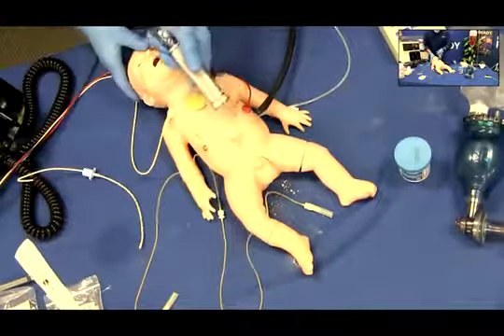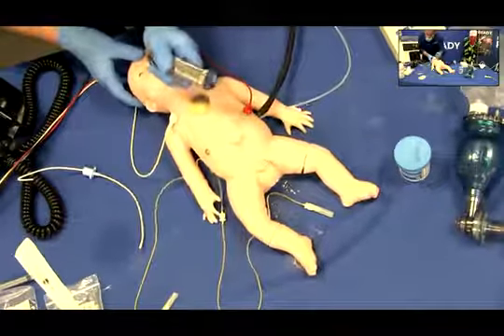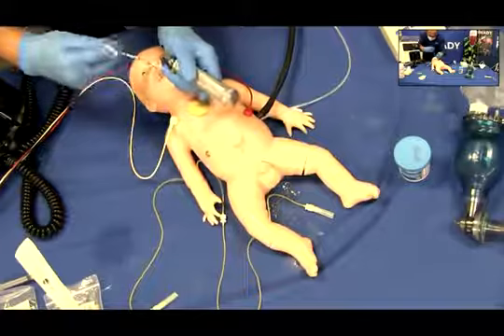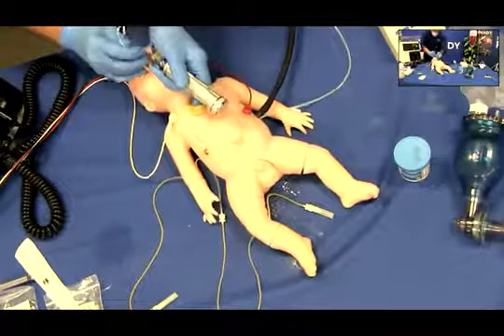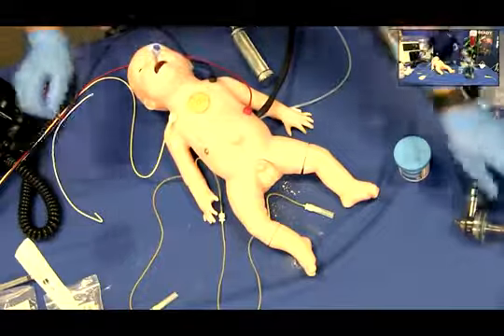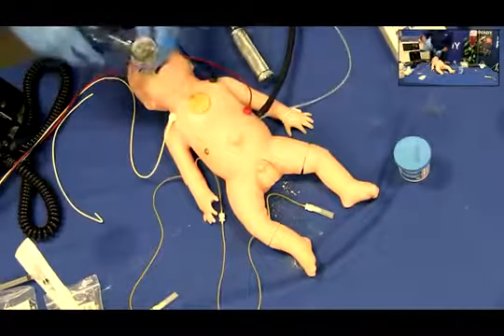Gently slide the blade into the mouth, depressing the tongue to view the airway. Insert the ET tube or laryngeal mask airway following general practice guidelines to place the tube. Then you will ventilate the infant airway simulator using a bag valve mask following general practice guidelines.